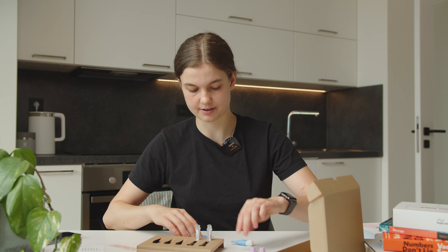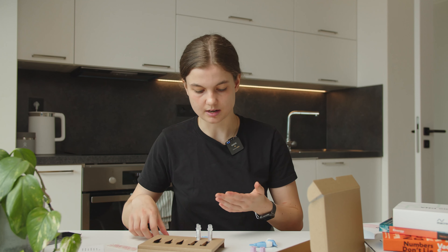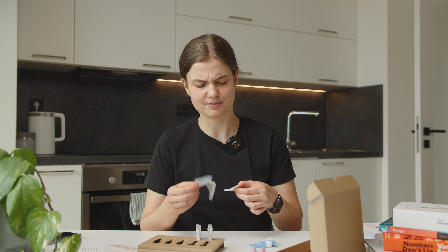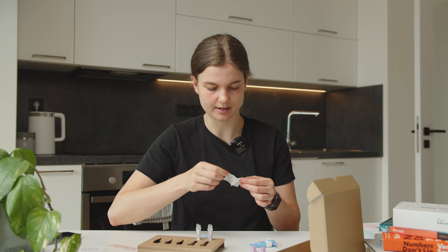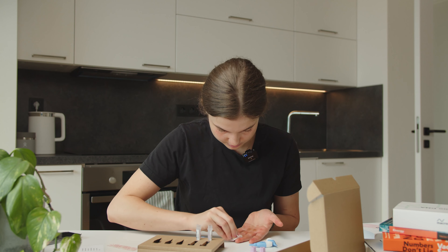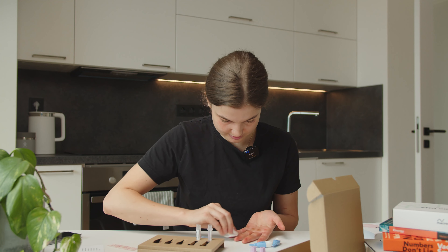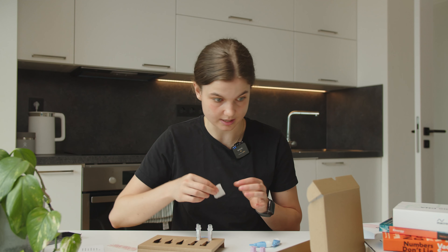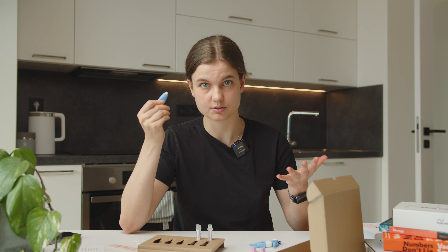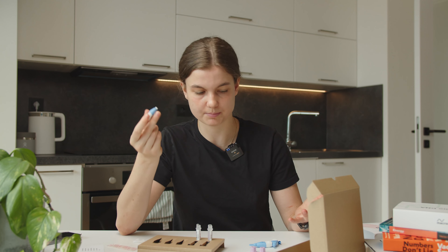So now here's how it works. I have three automatic lancet sets. I will prick my finger and collect the blood in the vials. It's important to use the alcohol wipe for disinfection first — we don't want any bacteria. There's a little spring inside the lancet that will push a small blade to prick my finger. It doesn't hurt at all — it's very easy.